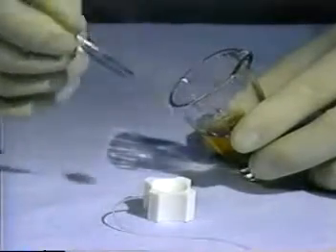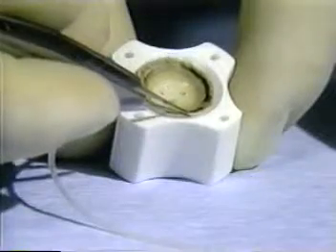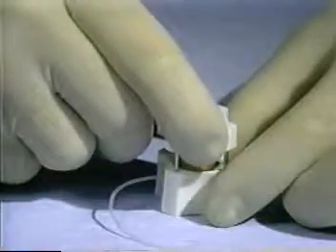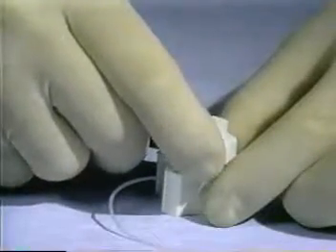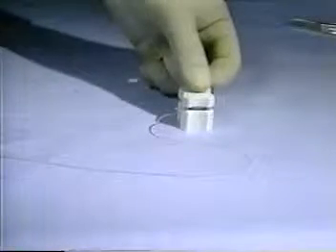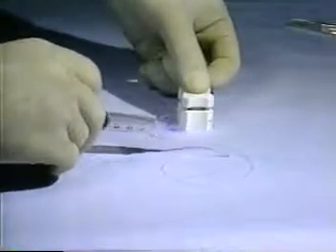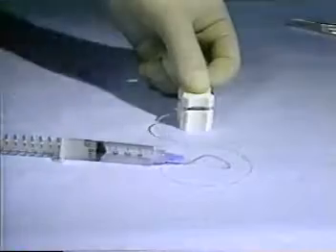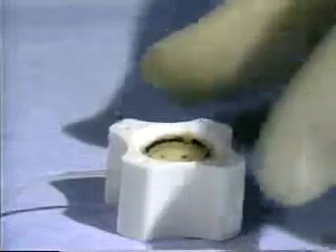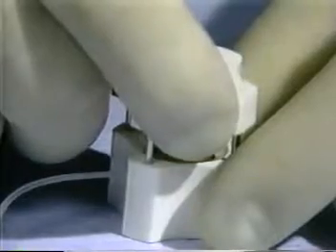The donor cornea is placed endothelial surface up in the well of the cutting block and is centered. The guideposts of the seating ring are inserted into the holes in each corner of the cutting block and the seating ring is pressed down gently to make sure the vacuum will hold the cornea in place. The plunger of the syringe is released abruptly to create a vacuum which will hold the cornea in place as the seating ring is removed and replaced with the blade assembly.